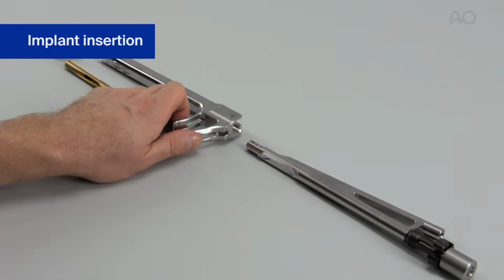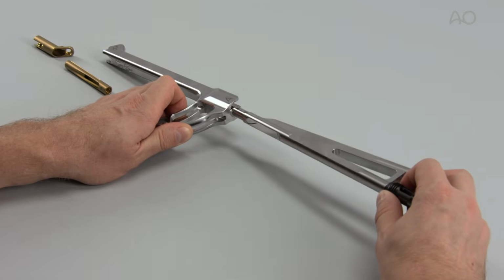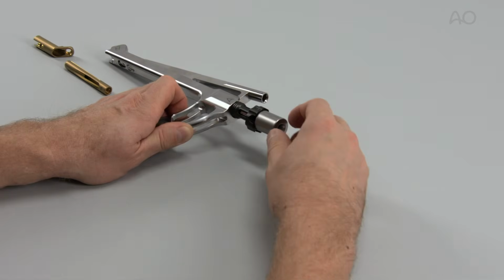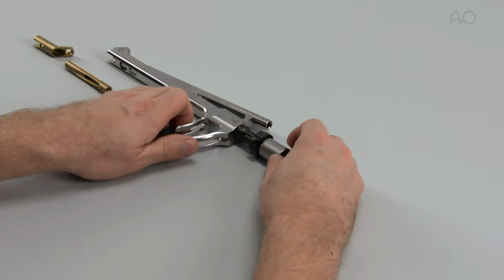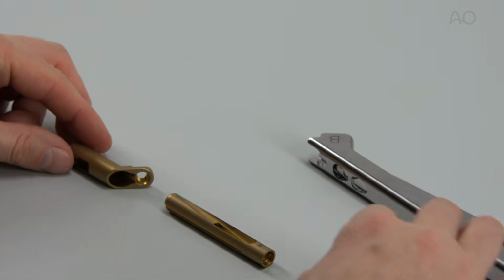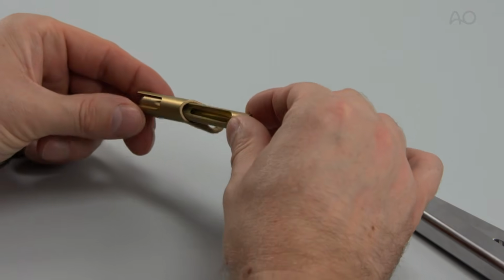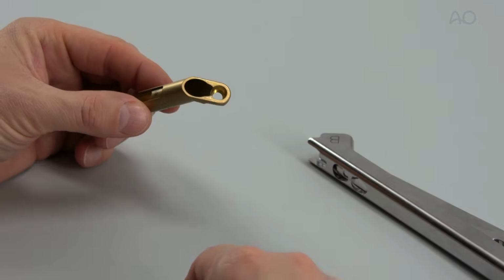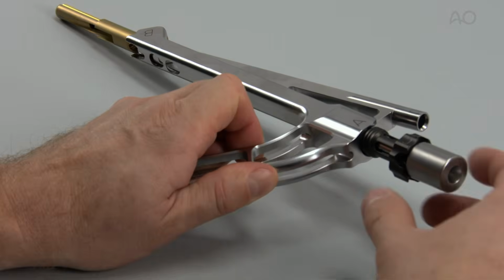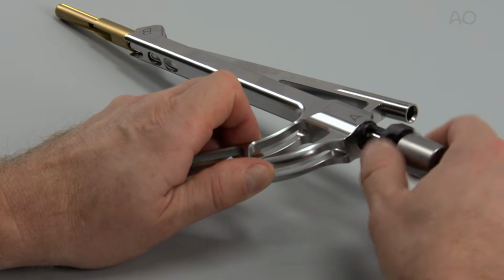The insert is slid into the insertion handle. The bolt with the selected construct size, 85 mm in this demonstration, is fully inserted into a one-hole plate. The assembled bolt and plate are slid into the slot of the insertion handle. The black screw is manually tightened to secure the implant.